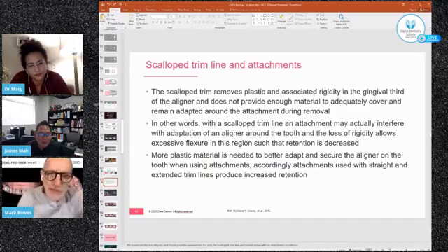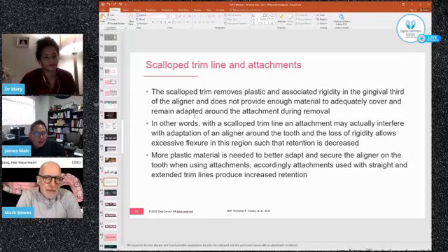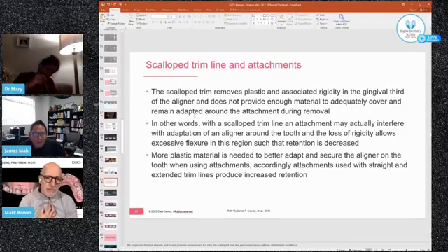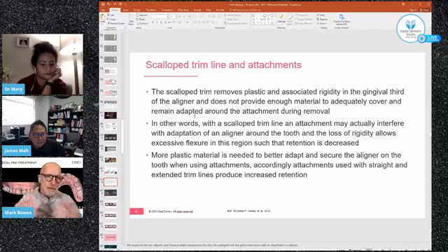What about thin biotypes and maybe recession and being careful about what's going on? Is there any kind of mention when you're doing your diagnostics about exactly what's happening? Yeah. Even from a moving tooth point of view, this always worries me, that dentists don't have any idea about the bone volume, the biotype, and now we're moving teeth outside of the arch.